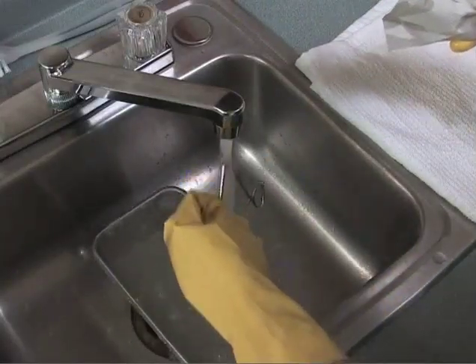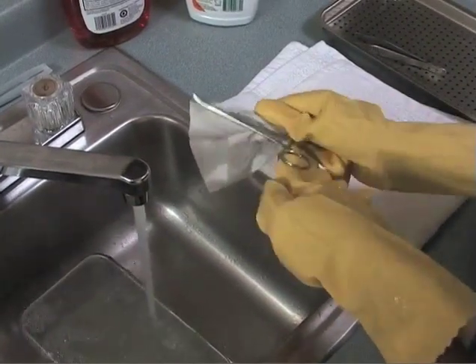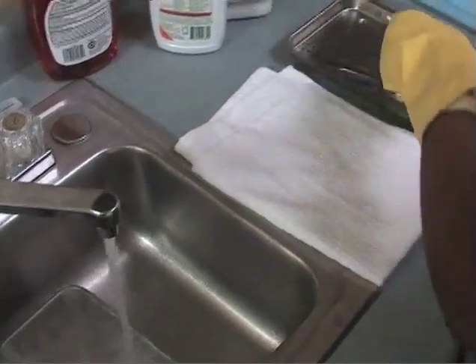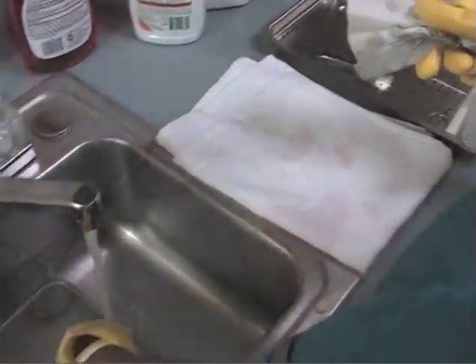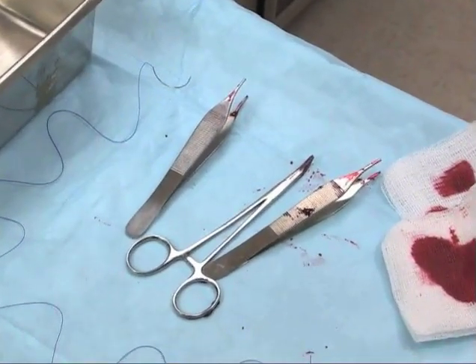Instruments and materials used for invasive procedures must be sterilized — that is, all microorganisms or spores must be removed to prevent transmission of pathogens to the patient. All instruments to be sterilized must first undergo sanitization, then disinfection.